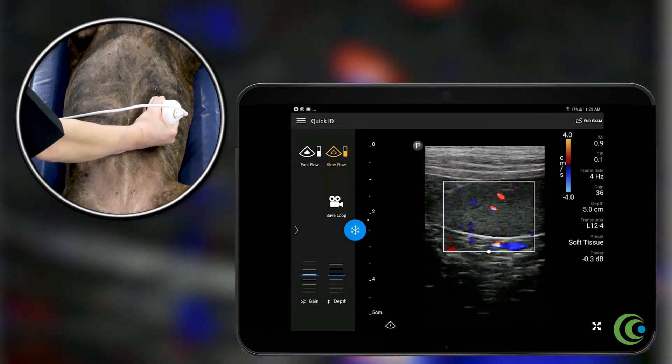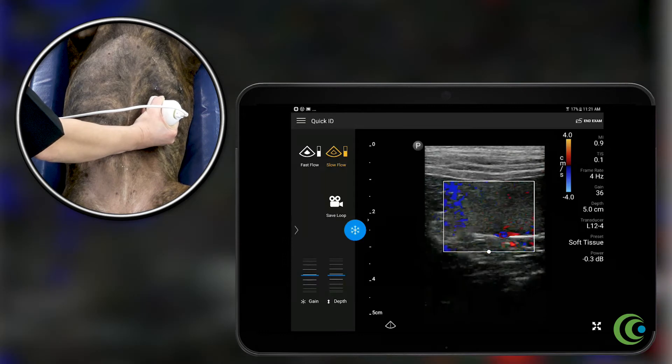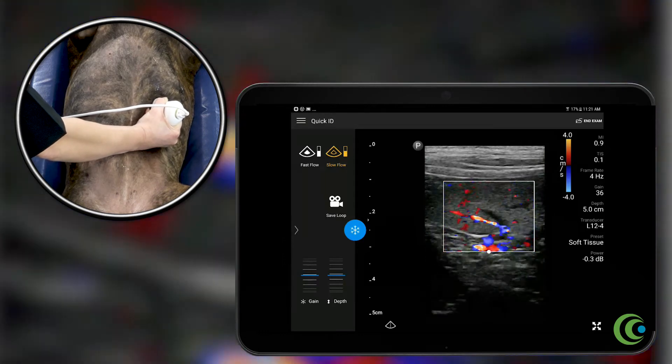Just fan through the spleen — no filling defects. Red is towards the probe, blue is away.